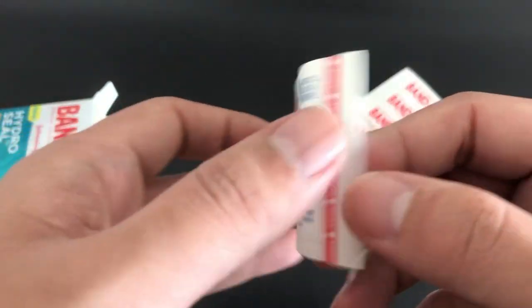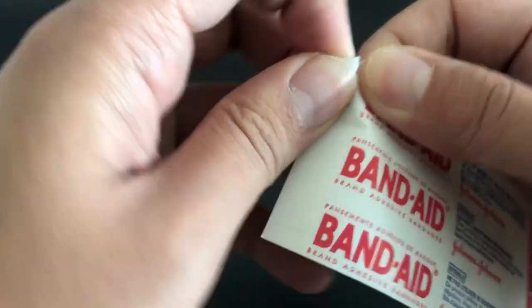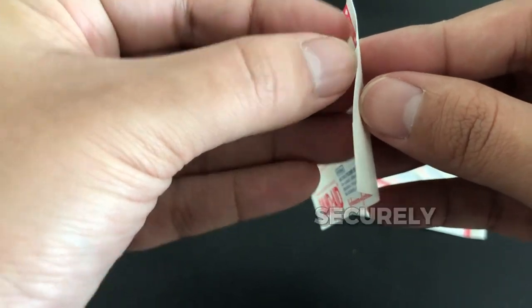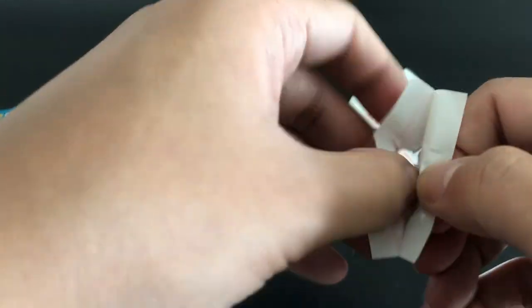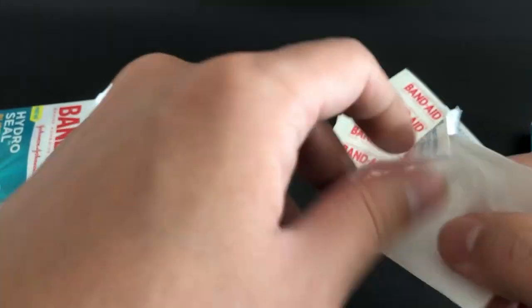I have personally used the Band-Aid brand HydroSeal Adhesive Bandages for heel blisters and found them to be incredibly effective in protecting, healing, and preventing my heel blisters from getting worse. They fit securely and comfortably and the non-stick pad prevents it from sticking to the wound. Overall, these bandages are a great option for those looking for a secure and non-stick adhesive bandage.